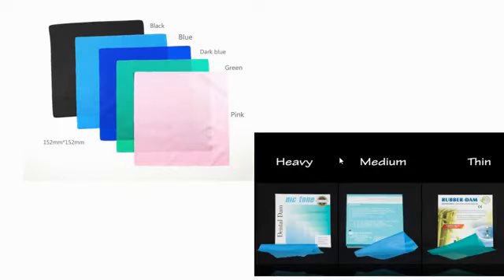ठीक है. So the sheets come in different colors, or you can see Nictone, one of the best companies, and I'll say you can add a few sheets of other companies also. So Nictone is one of the good companies which you can use. The elasticity is pretty good and it's now easily available also. And these are the different colors and the sizes as I told. So sheets के बारे में I think clarity is there.